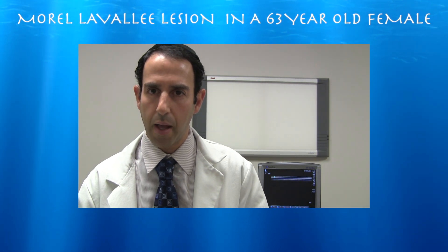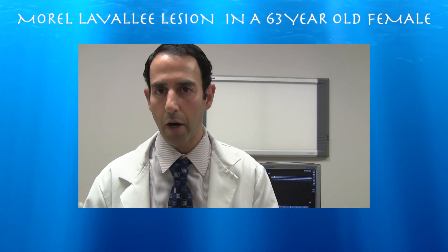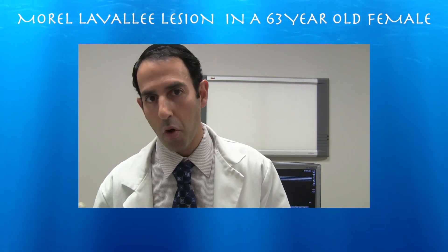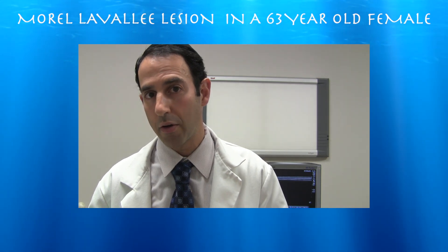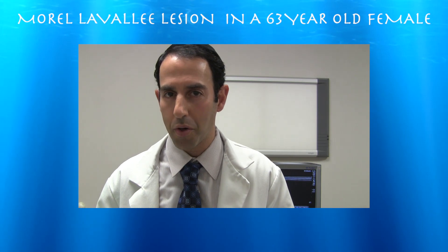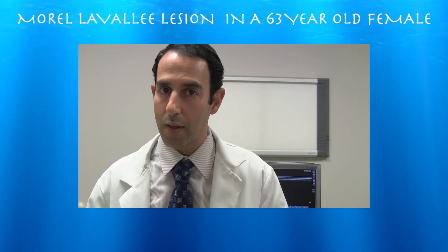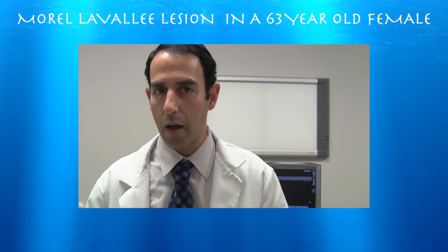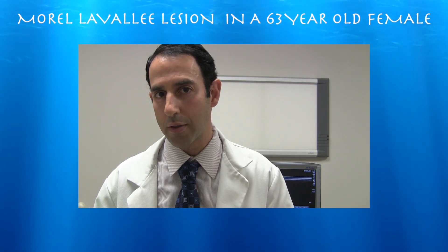This is a 63-year-old female who fell through a wooden deck. The lateral aspect of her right thigh skimmed through an opening in the deck, causing a near-gloving injury called a Morel-Lavallée lesion. She had a very large fluid collection in the subcutaneous tissue on the lateral aspect of her right thigh, and this series will show three separate drainages.